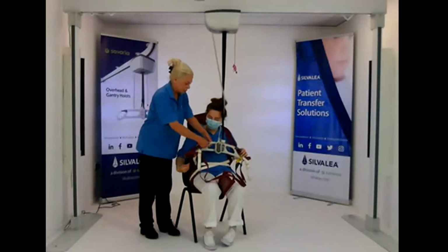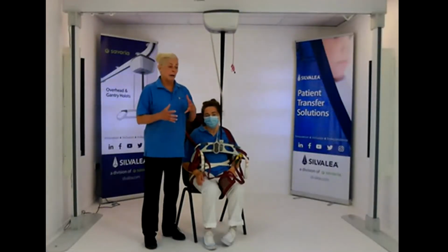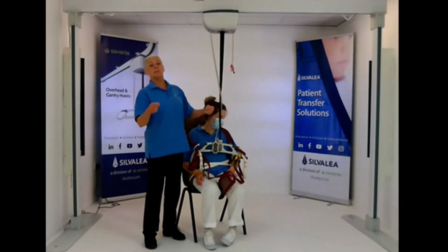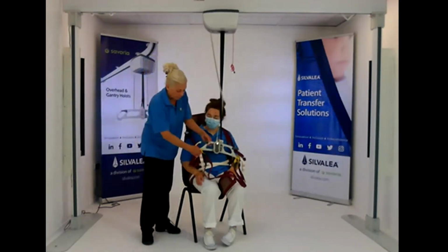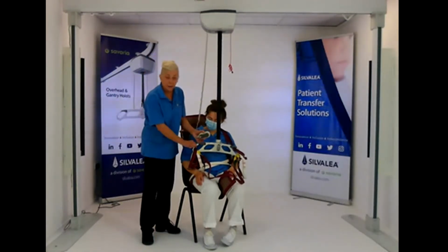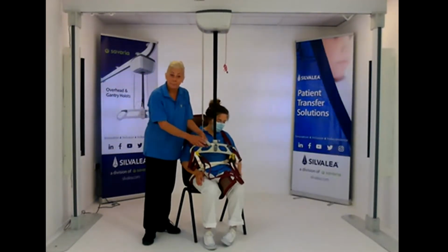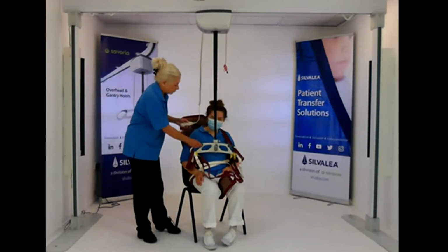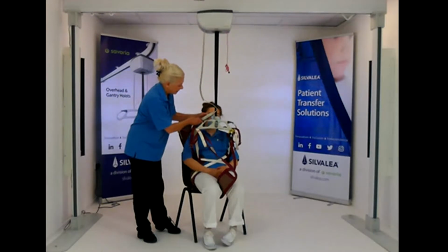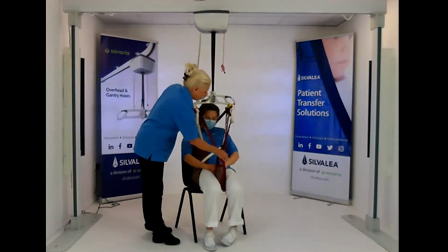So we're looking at a situation where you've got someone that maybe has a bit of movement, they're a little bit more active, so that this counterbalance will allow them to move and it will just flow. If it's on top on this type of hoist with 1 hook, if you've got other hoists that have got 2 hooks, put it on the back or the side, there's 3 hooks. So if there's 1, just make sure it goes on last. I'm just going to take out the slack, make sure we've got everything connected.